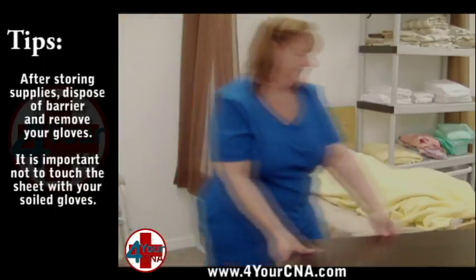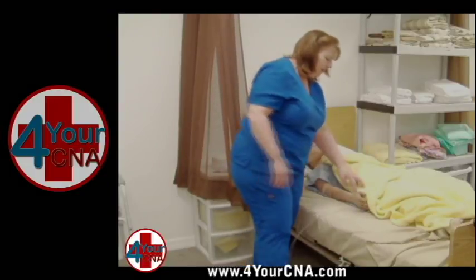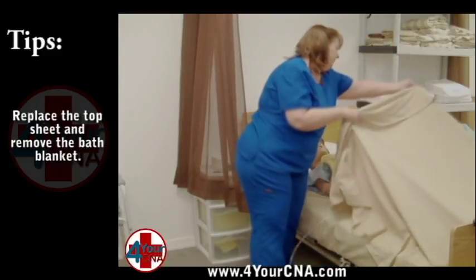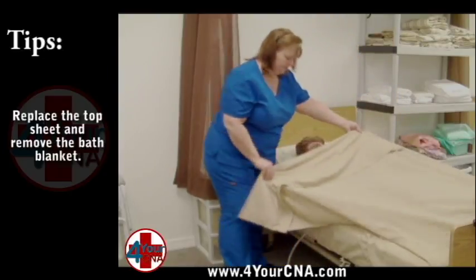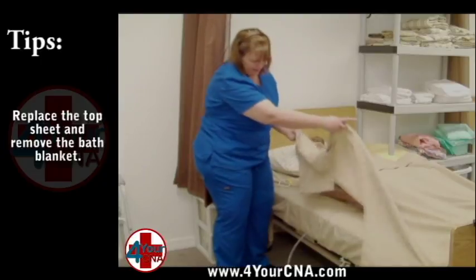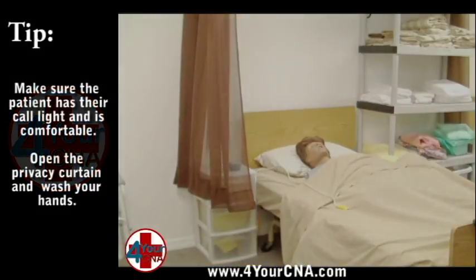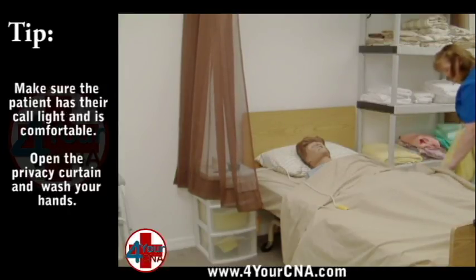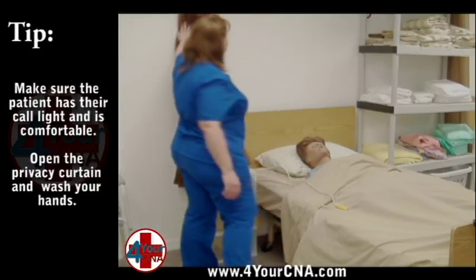Explain that you will be removing the privacy blanket and restoring the sheet over the patient. Remove the privacy blanket by touching only the underside of the blanket, being careful not to expose the patient unnecessarily. Pull the sheet up over the patient as you remove the blanket. Adjust the linens for privacy, comfort, and appearance. Ensure the patient has her call light and the patient's environment is neat and clean. Ask if she needs anything else. Place the blanket in the soiled linen. Open the curtain and wash your hands.